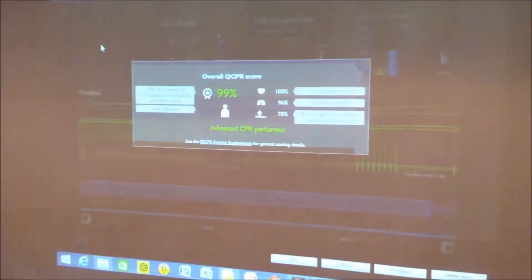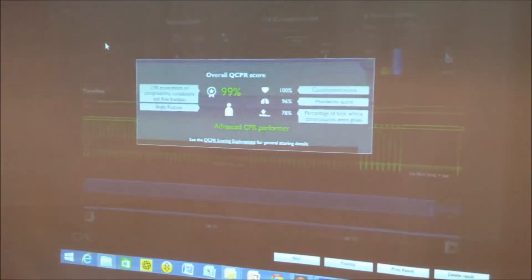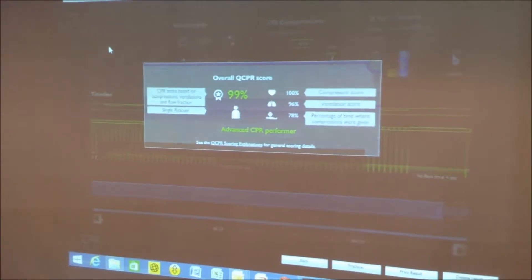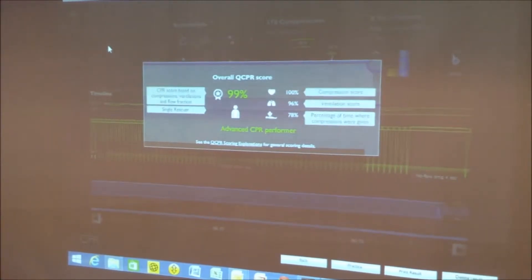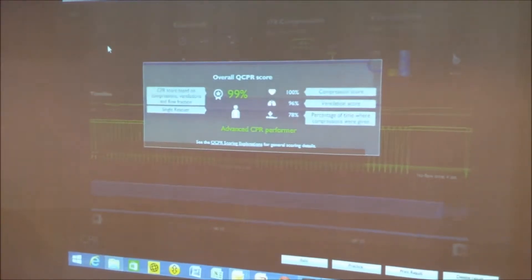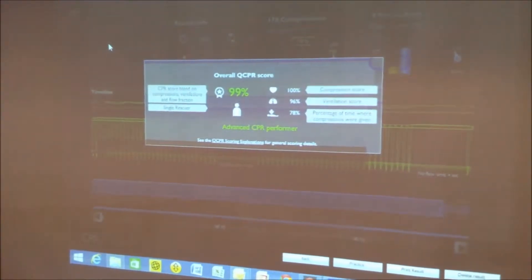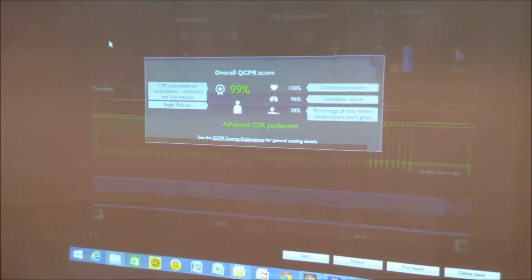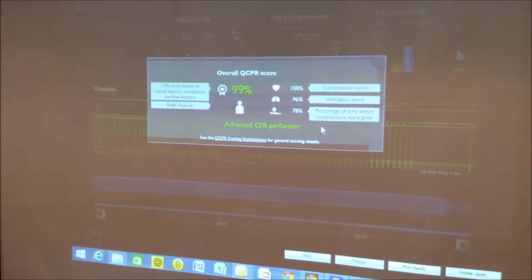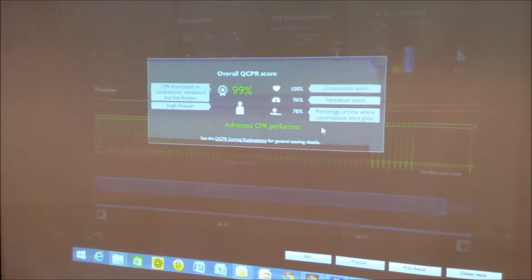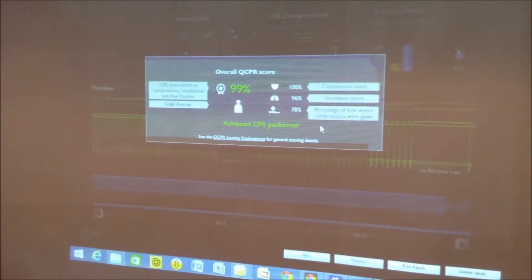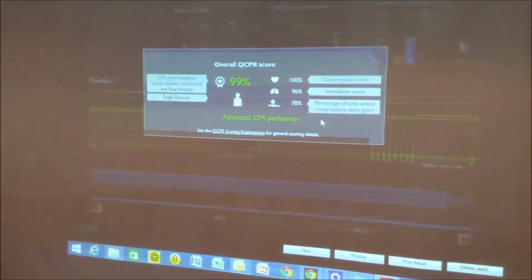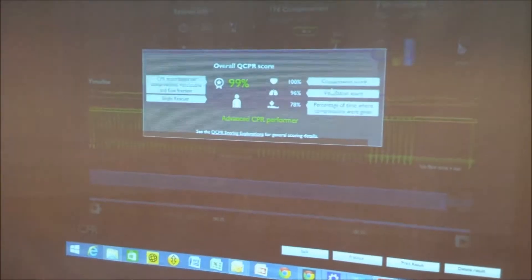What we can see clearly here is that this participant did very well. They were practicing their quality CPR skills on an adult mannequin and scored 99%. That's a superb score but it's interesting when you see the data that sits behind that.